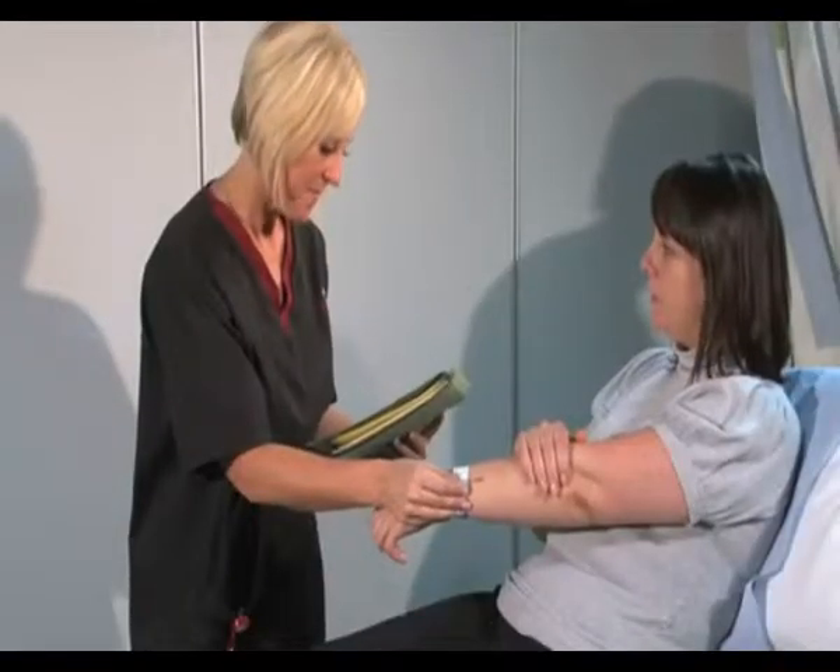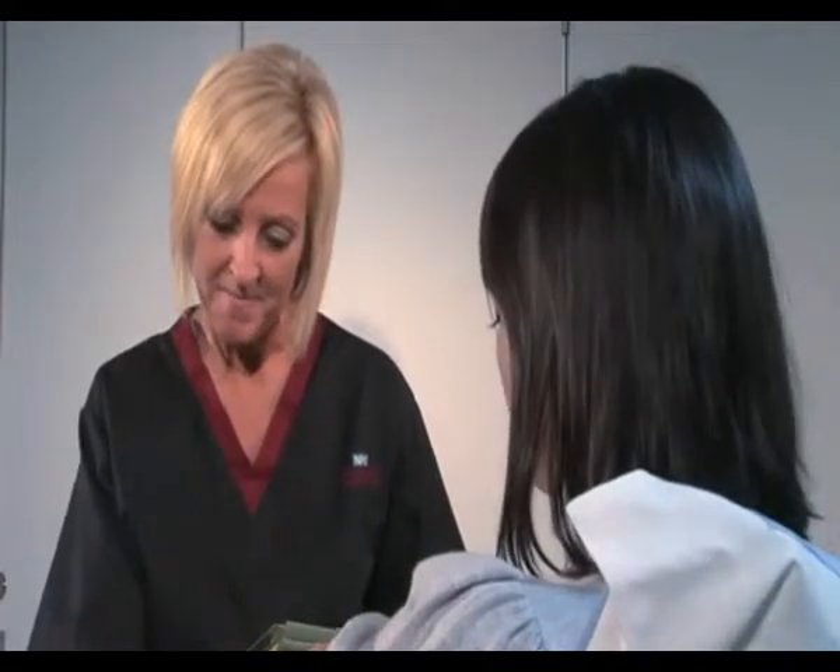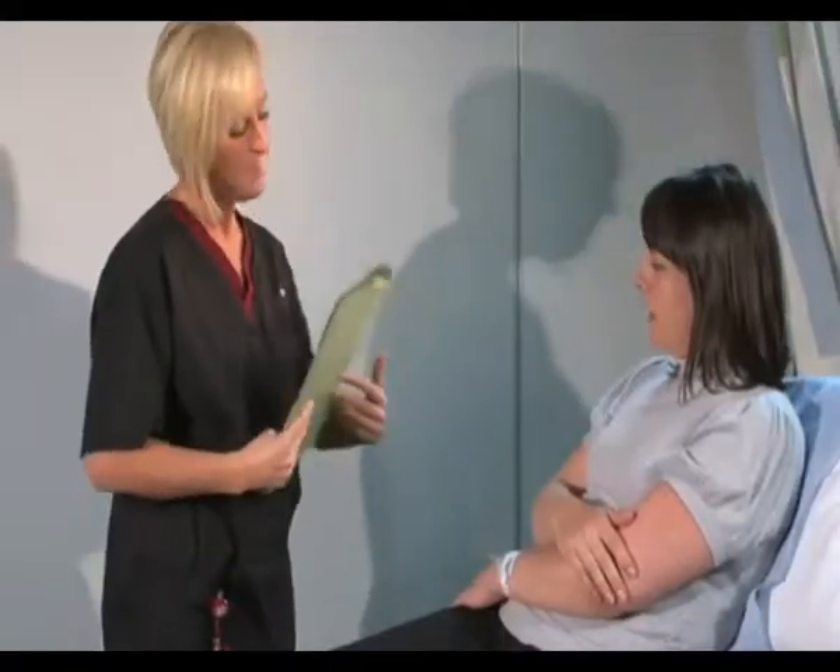And your date of birth? It's the 9th of the 9th of 78. Okay, and I'm just checking your hospital number. Is it all right if I call you Kelly? Yeah, that's fine.